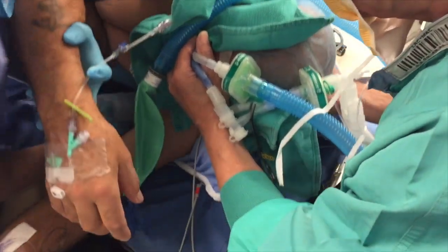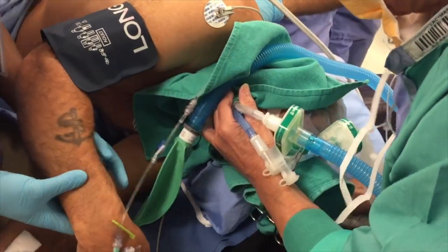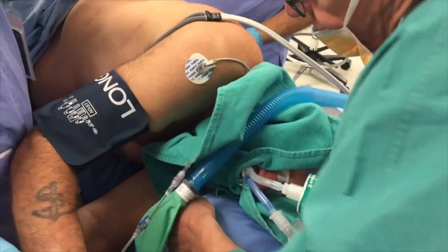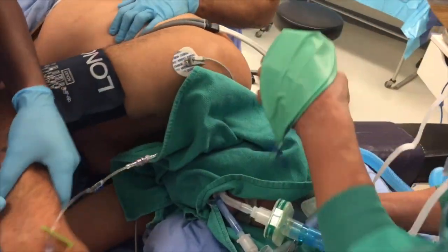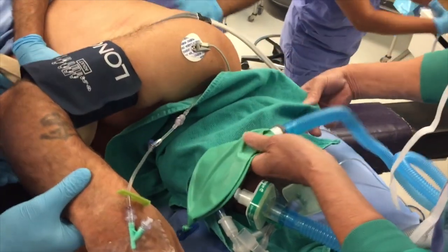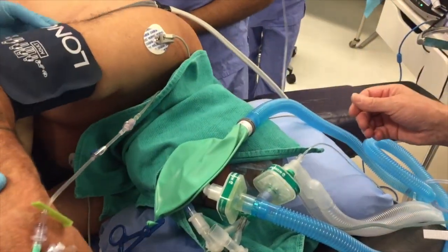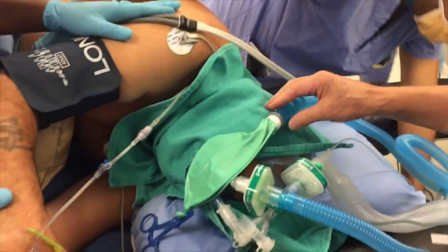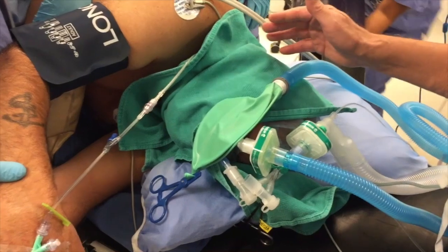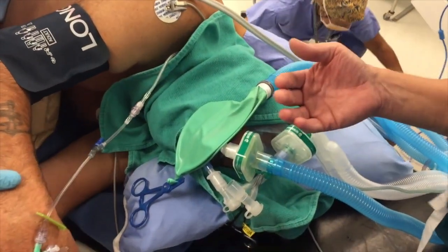I don't have to overflex the head, which can cause its own set of problems. This whole process may take 3 or 4 minutes before I have a chance to get down with a flexible bronchoscope to confirm correct position. With this technique, I'm confident that when I go down with that flexible bronchoscope, because I haven't overflexed the head and I haven't seen a leak, that double lumen tube is going to be very close to the position that I wanted, the ideal position, so to speak. Yeah, there you have it.